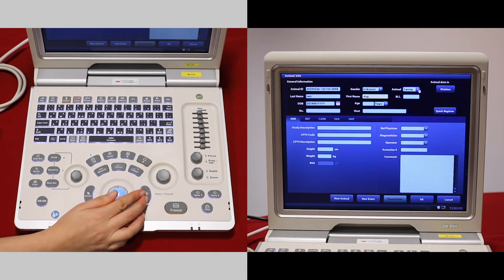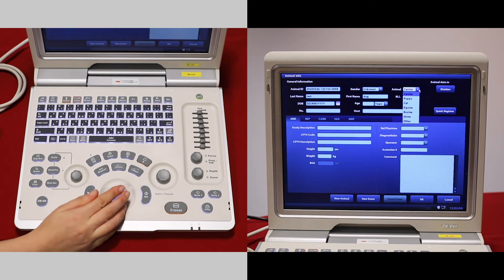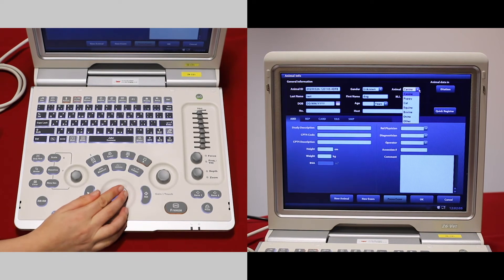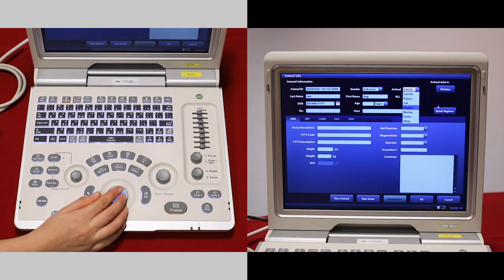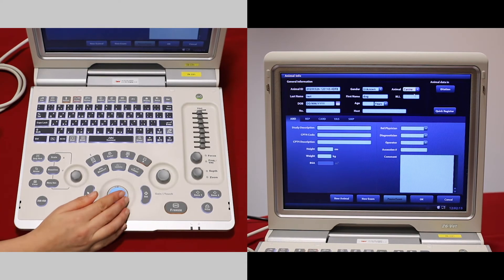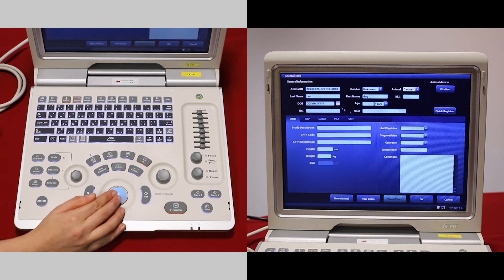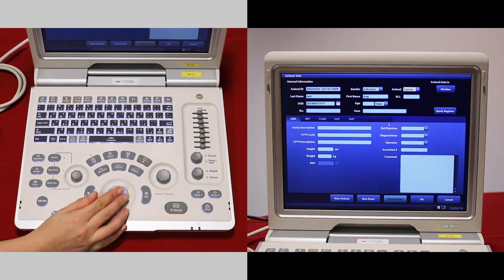Also select what species you're scanning. We've made veterinary presets for the canine, cat, and equine species, so please pick one of those. Anything else can be inputted but is optional.